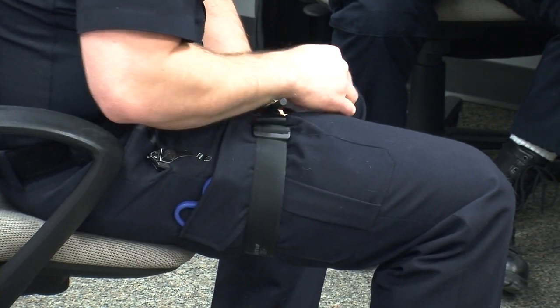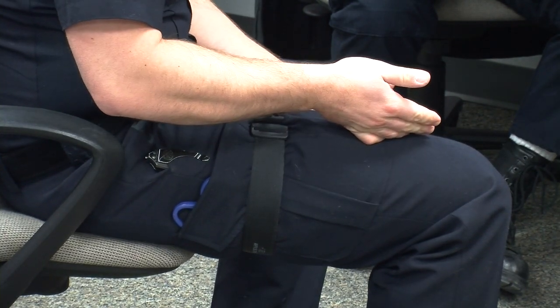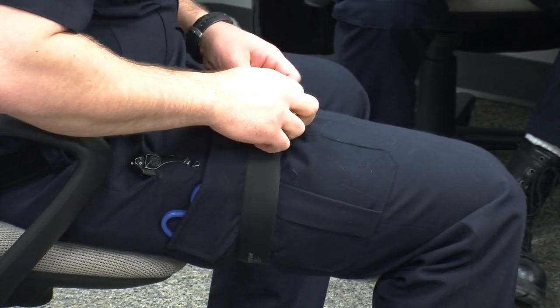Yeah, when you're training like this, I don't have anything to go off of because I'm not bleeding. But in real life, you keep cinching that thing down until all the bleeding stops and locking it right there. I mean, that simple. Go ahead and try it. Try it on your weak arm, your leg. Give it a few shots.